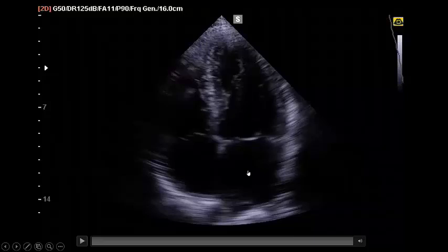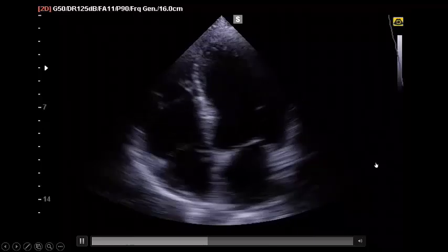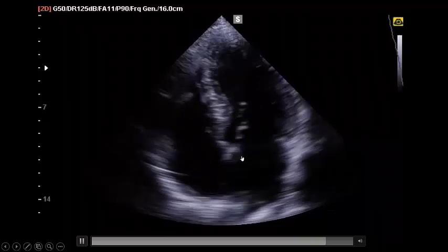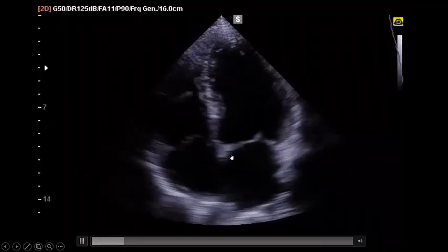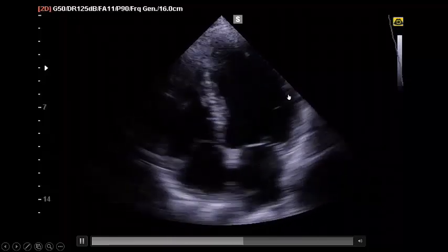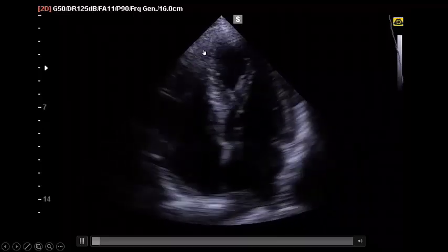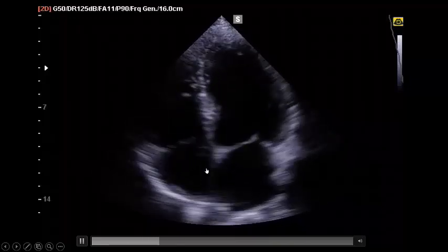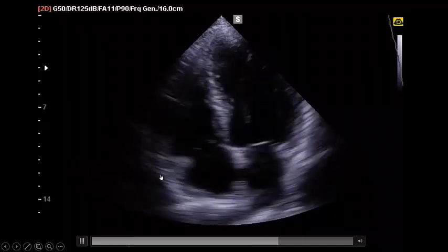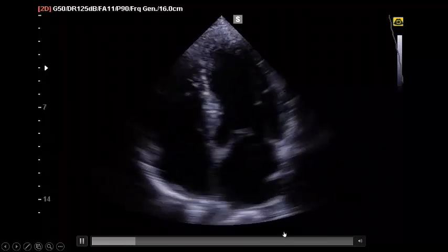We start to assess the left ventricular function of the patient by visual assessment, four-chamber view. As you see, there is good shortening and thickening of the lateral, anterolateral and inferior-septal wall, and good upward movement of the lateral annulus of the mitral valve here, and the right side is not dilated. It's almost 60 to 70% of the left ventricle, and the tricuspid annulus here is going properly in an upward direction. The visual TAPSE here is okay, and there is no pericardial effusion.